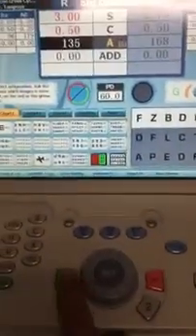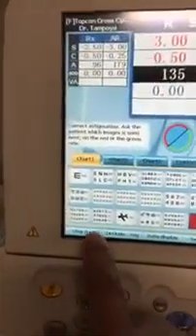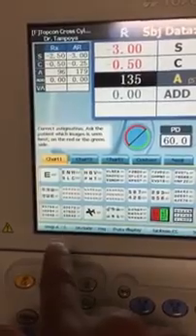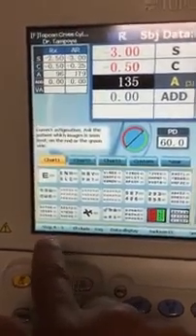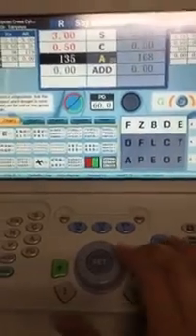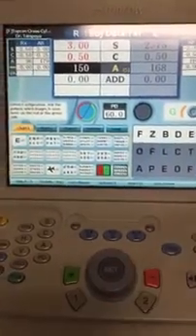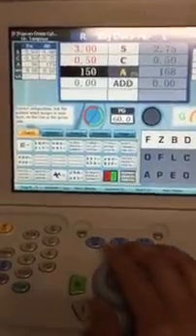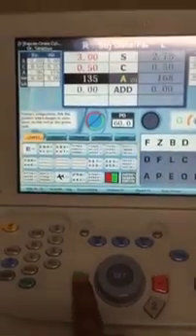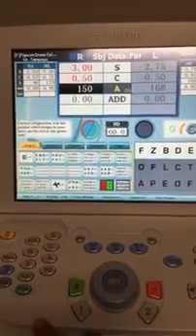And again, I can press the button or I can turn the knob. If you look right here where it says step A5, basically that means that the axis is going to change by 5 degrees. So if I want 15 degrees, I'll move it 3 times in the green direction. Here's 1, 2, and 3, okay? Alternatively, I could do the button and I could go 1, 2, 3, okay?